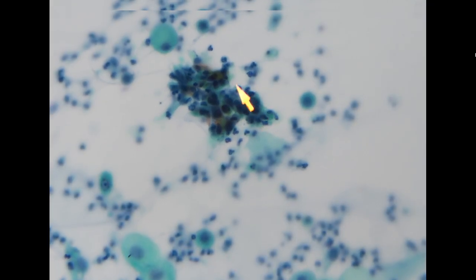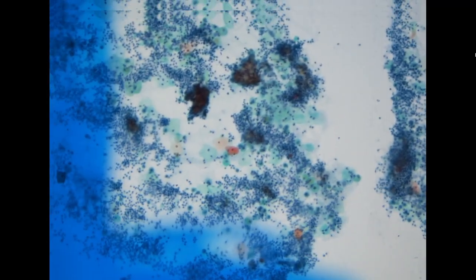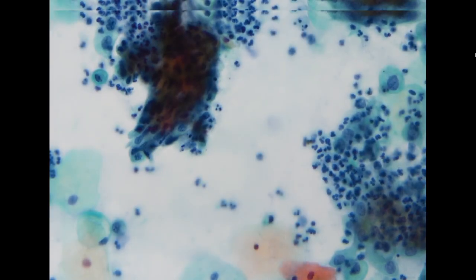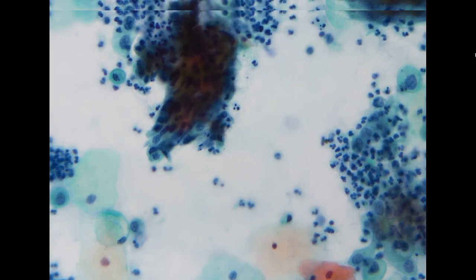But because of the spindle shape, these are still more likely to be squamous epithelium. Whenever we see a cluster of cells with atypia, the first thing we need to confirm is whether this is a squamous epithelium, a glandular lesion, or something coming from elsewhere.